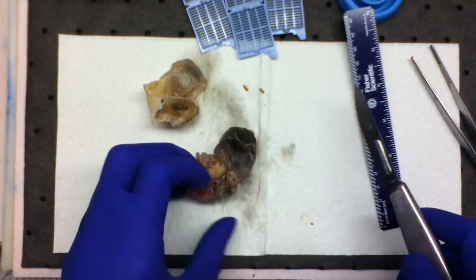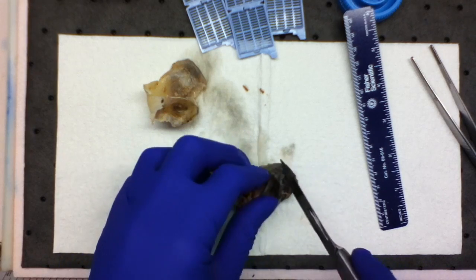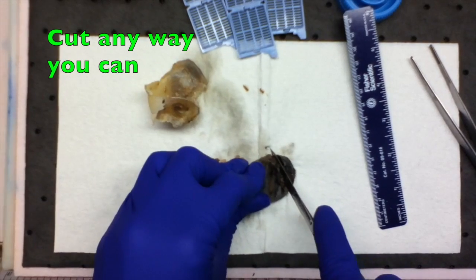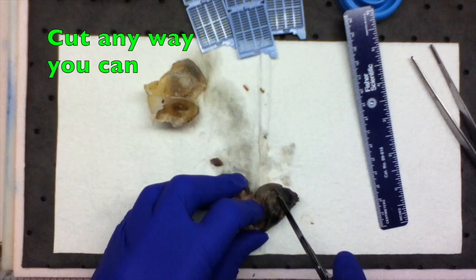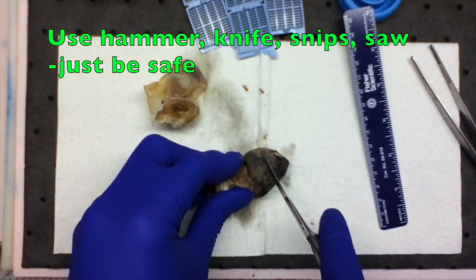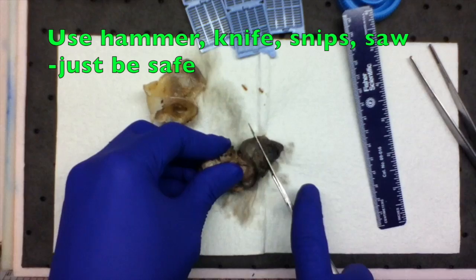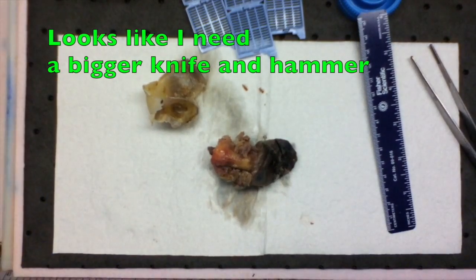Okay, so now we want to look at what's going on under here. I think there's going to be some bone involvement. So just take your knife, cut into it. There is a nail there. Alright, it's actually pretty firm.